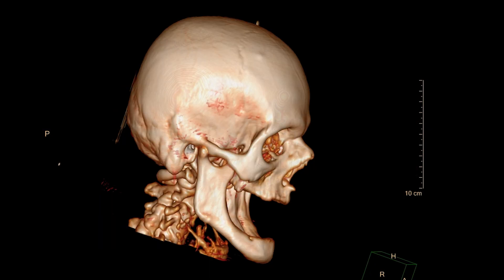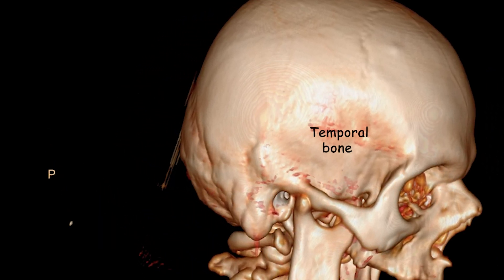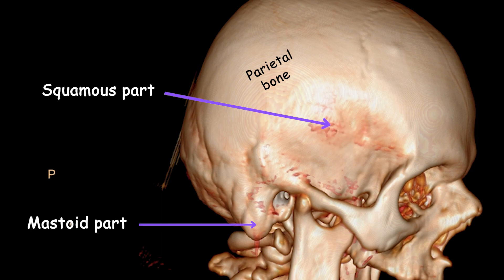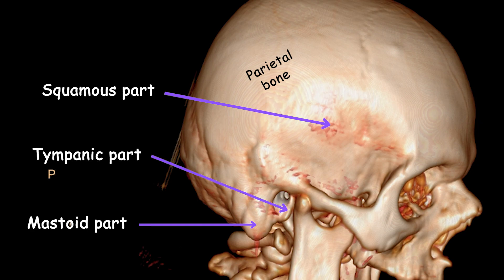The temporal bone is a paired bone located on the lateral sides and base of the skull. It is one of the most complex bones in the human body, positioned inferior to the parietal bones and anterior to the occipital bone. Each temporal bone consists of several parts, including the squamous part, petrous part, mastoid part, and tympanic part. In the 3D reconstructed CT scan image, you can observe the squamous, mastoid, and tympanic parts.